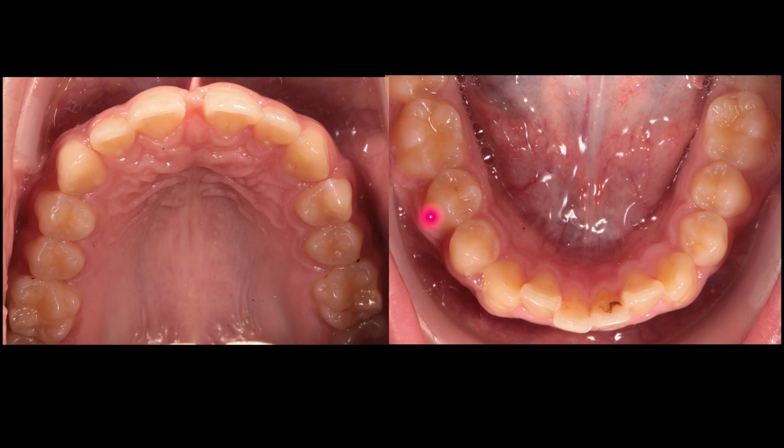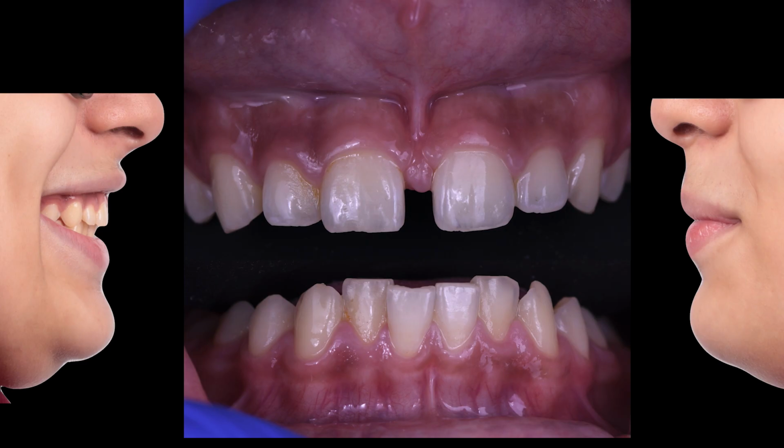From the occlusal view, we can see anterior spaces localized in the midline and lower crowding distributed in the 6 incisors. In the contrast photo, we should focus on the frenum, and this patient has a thick labial frenum between the 2 central incisors.